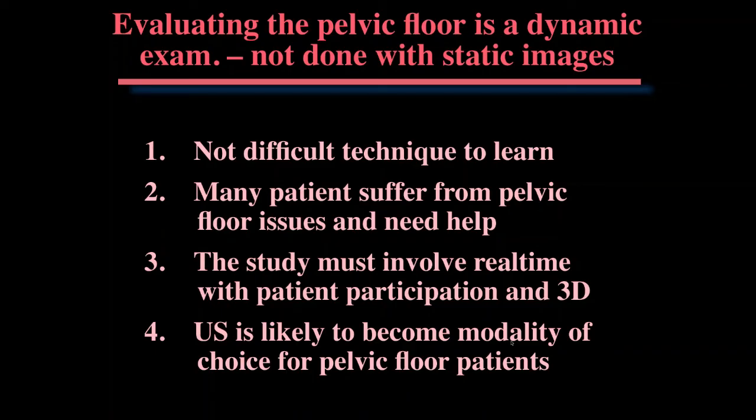The study must involve real time, and it must involve 3D, and it must involve patient participation, where you can talk to the patient, have her Valsalva, or squeeze or do different maneuvers to help you see what happens to the pelvic floor during these different maneuvers. And I think ultrasound is likely to become the modality of choice for the pelvic floor patients. I mean, it used to be MR because the ultrasound didn't have 3D and you couldn't look at the pelvic floor en face. But now that you can, I really think that it's the way to go.